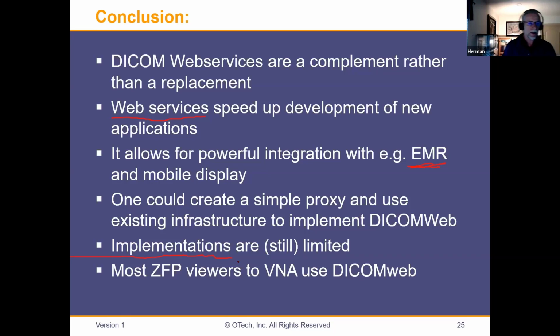I actually looked for PACS conformance statements, and there were only very few that I could find that have a very nice specification of the full WADO, QIDO, and STOW features. So either most vendors are still hiding it, or they don't want to advertise it.